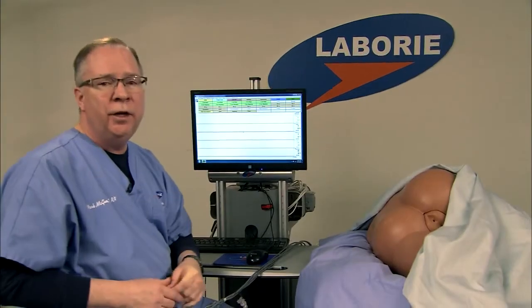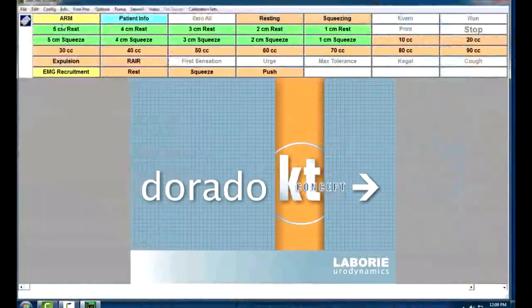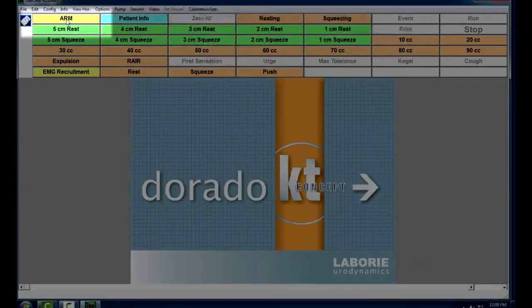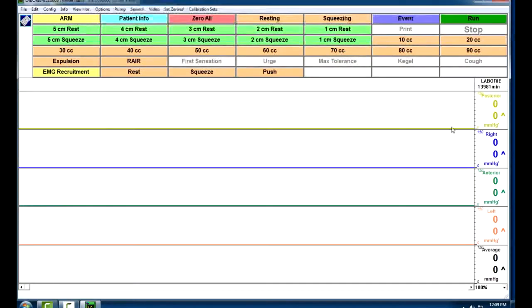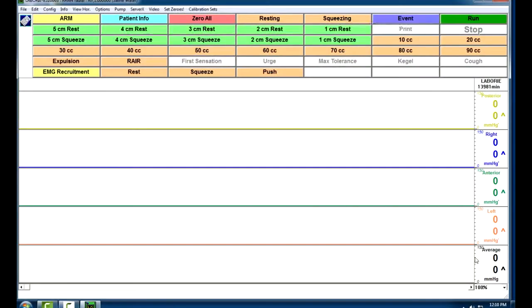Let's go ahead and start the anorectal manometry procedure now. On the software, we'll go ahead and click the arm button. That brings up the various channels. We have posterior in channel 1, the right segment of the catheter we'll be measuring in channel 2, anterior and left. You can see there, and at the very bottom, we have average.